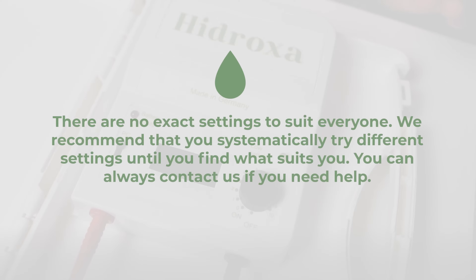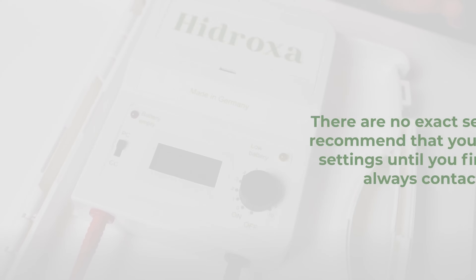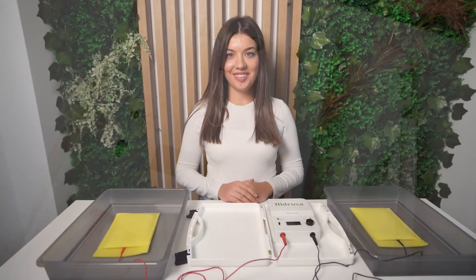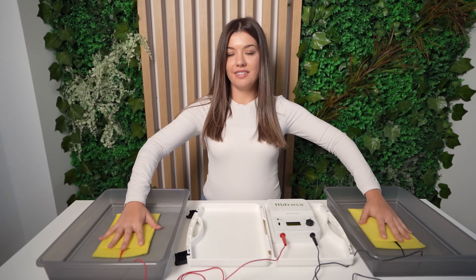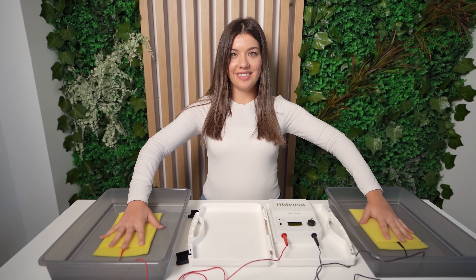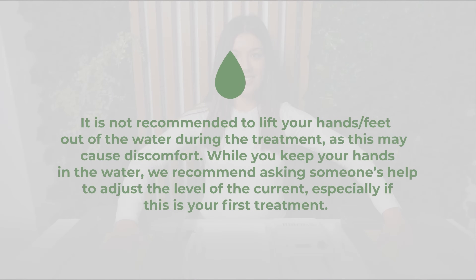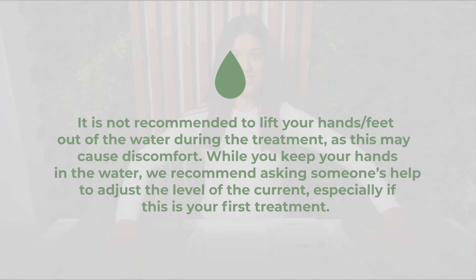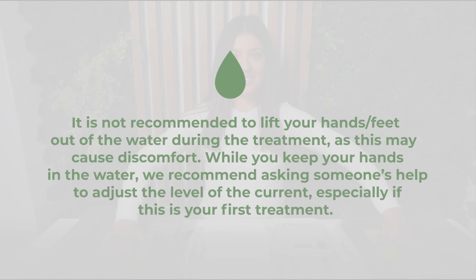You can always contact us if you need help. Now you are ready to start with your treatment. Place each hand on top of the electrodes, one in each container. This will start the treatment session. It is not recommended to lift your hands or feet out of the water during the treatment, as this may cause discomfort.